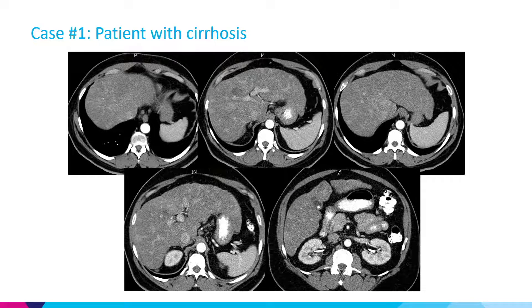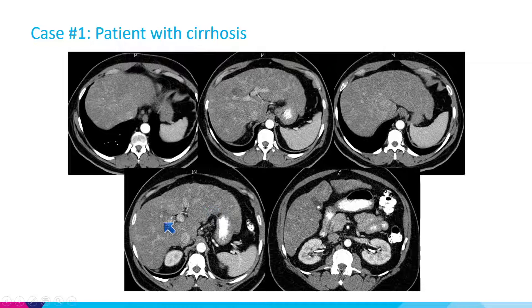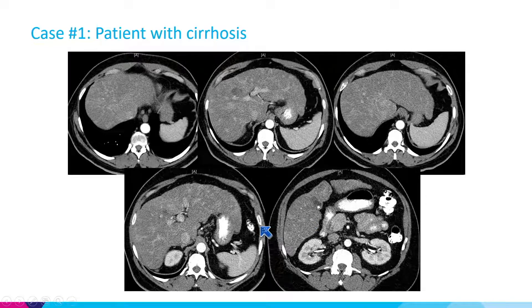This is a case we had a few years back with HCV cirrhosis and a CT from the outside. You can see these are arterial phase images — a really very complex appearance of the liver with multiple ill-defined areas of enhancement, maybe a lesion here. This was really hard to interpret based on the CT.